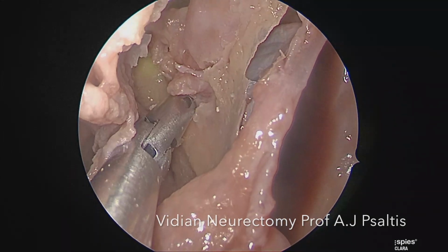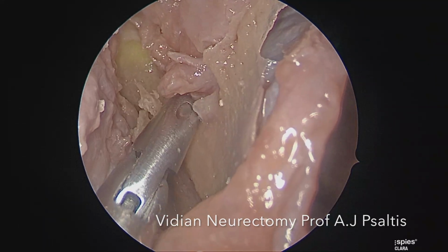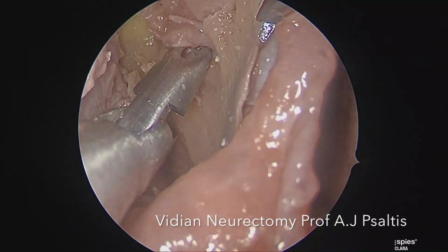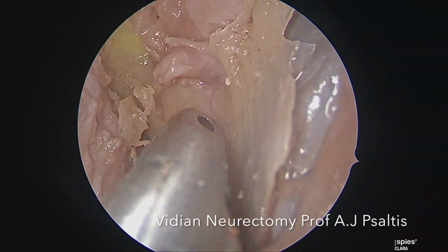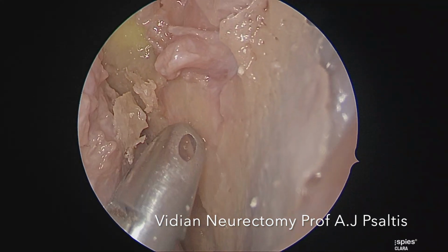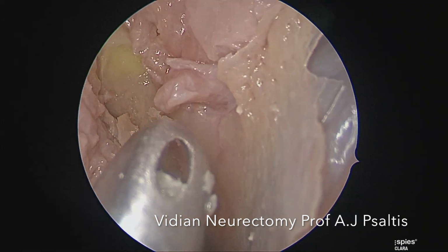This is probably the key step to the Vidian neurectomy. Removal of the bone identifies the periosteum overlying the pterygopalatine fossa. Beneath the periosteum lies the fat.